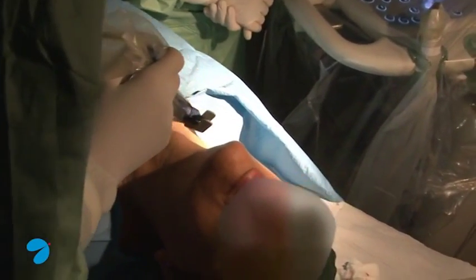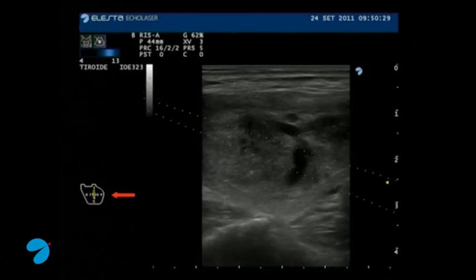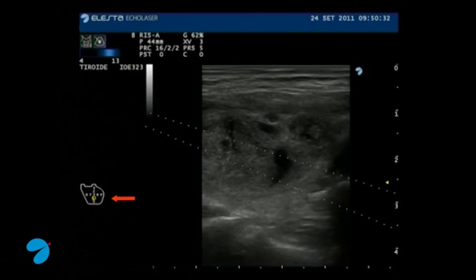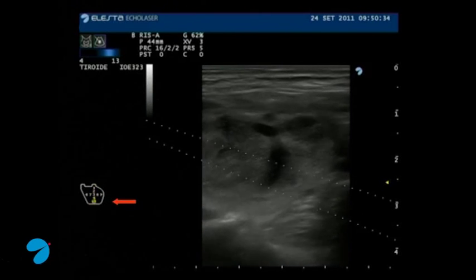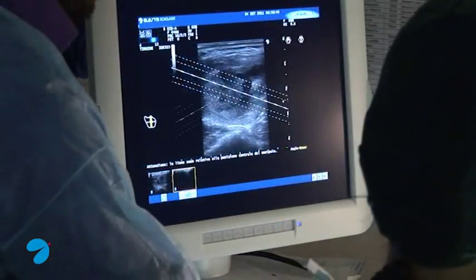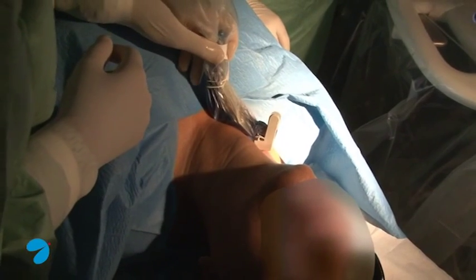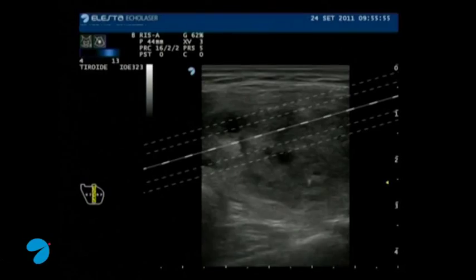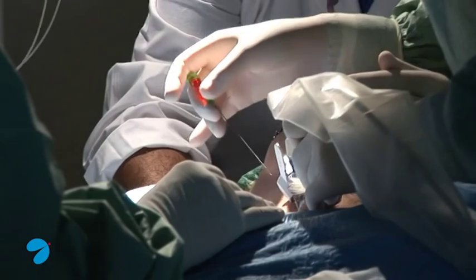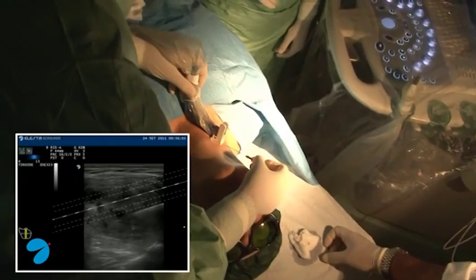We place the probe with the guide system on the patient's neck. It's possible to have different needle insertion cones on the screen. Five lines exist that correspond to five needle insertion points in the guide system. The guide system is placed on the patient's neck, and we proceed to needle insertion.